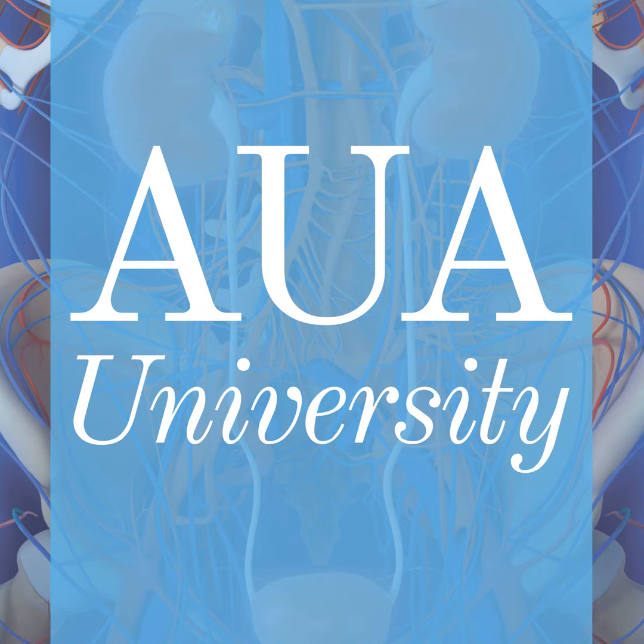So the role of PSMA PET scan in radiorecurrent disease, for patients who have received radiation treatment to the prostate and who recur. The problem of all these patients is still, even nowadays, this is a study from 2014, but even today, most of the patients who relapse after radiation treatment locally receive androgen deprivation therapy. So we give systemic treatment, although there is only a local relapse, which could be treated locally with a secondary option, which will result in a high cure rate.